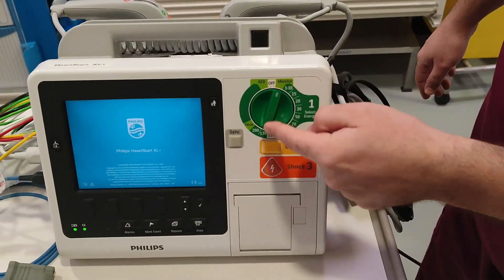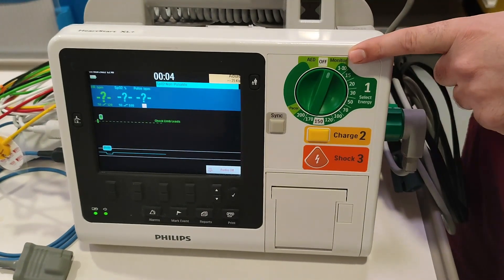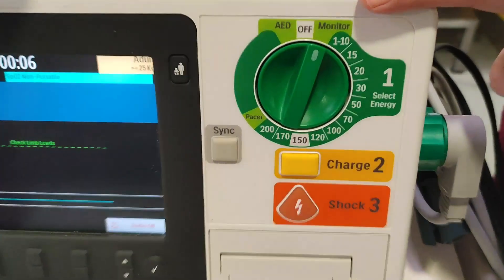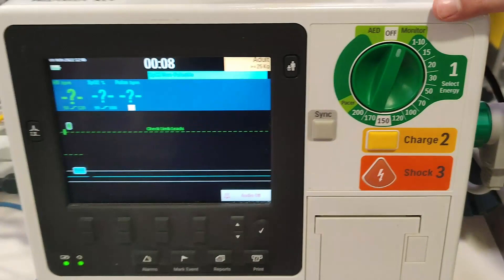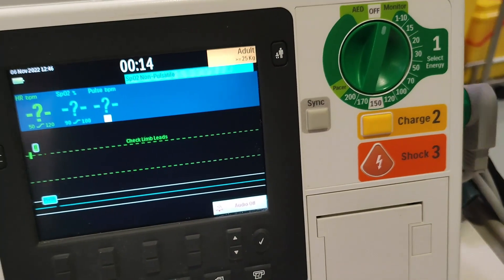Now let's turn on the defibrillator machine. As you can see, there is a regulator — you can set the desired joules accordingly. There is also a monitor mode: if you just want to monitor the ECG only, you can keep it on this mode.